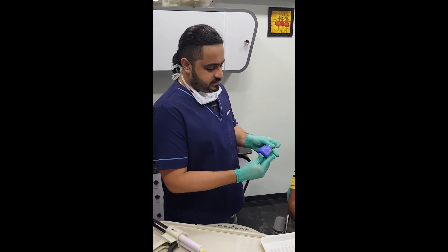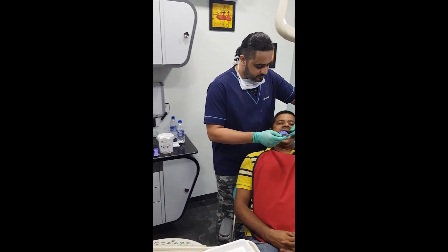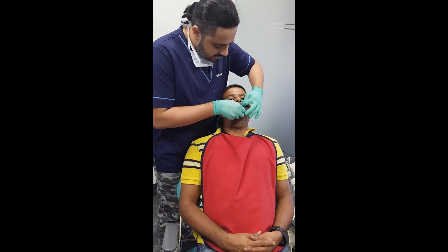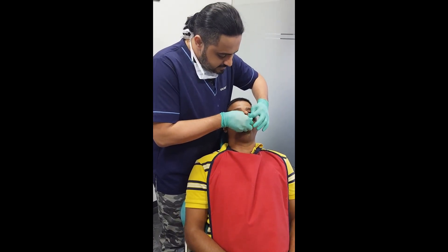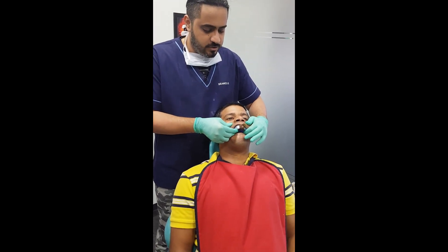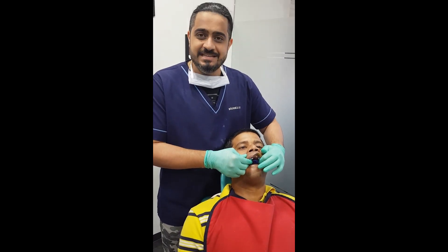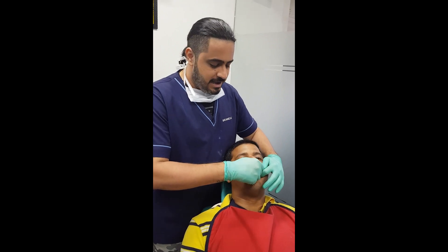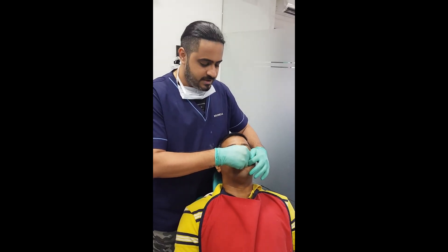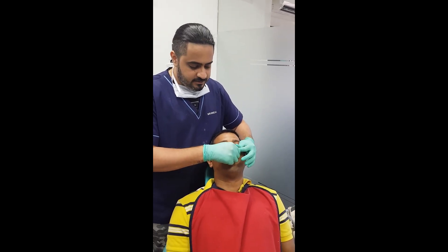Here we have loaded the tray with the putty material. I take this into the patient's mouth, orient it in the patient's facial midline, and seat it down until I feel an adequate material roll is present in the vestibular region. Now, before the material has completely set, I'm going to tweak the tray — I move it from side to side a little, I move it forward and back a little. This is just to create some space for the light body. I then remove it out.